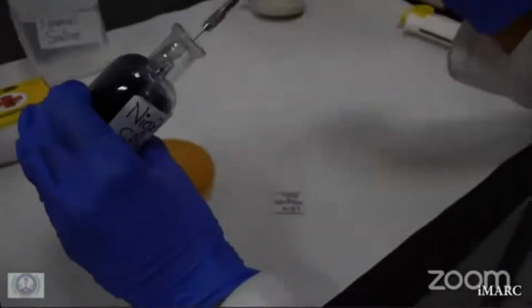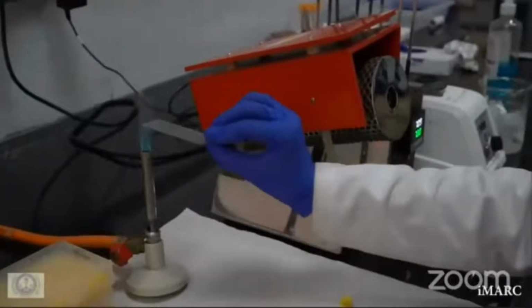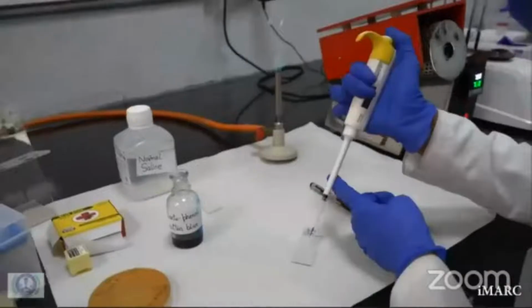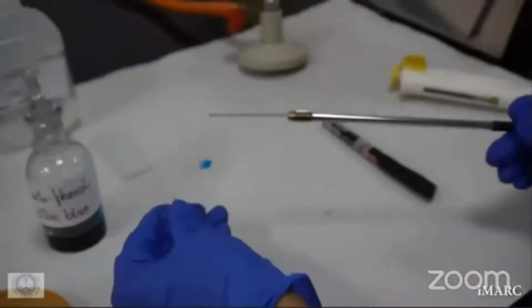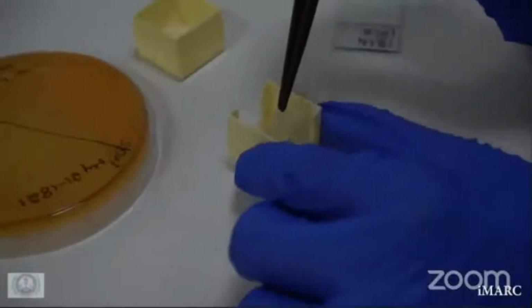Next step that can be performed is the LPCB direct mount. A lactophenol cotton blue direct mount is performed to study the yeast morphology, microscopic morphology, and to determine the purity of isolates.